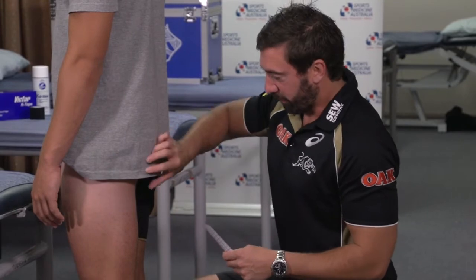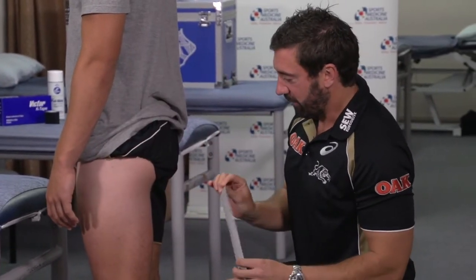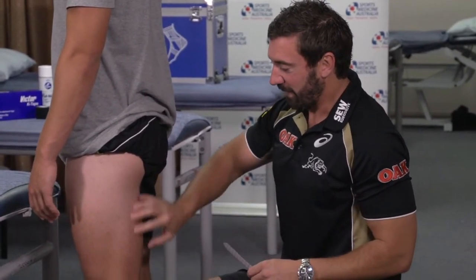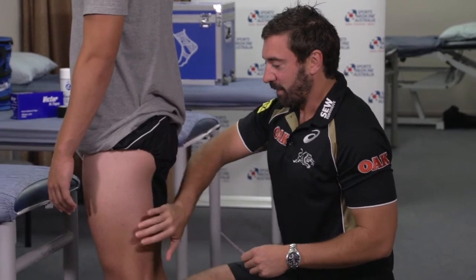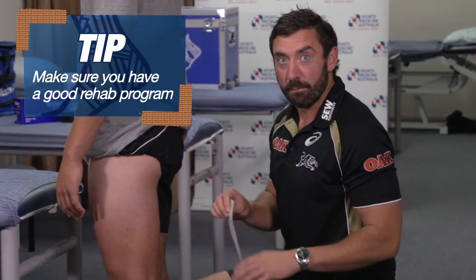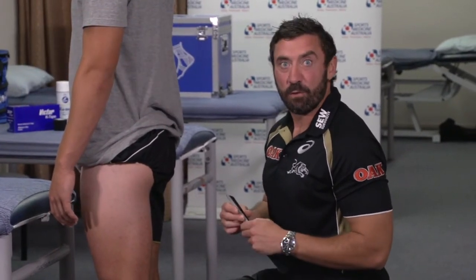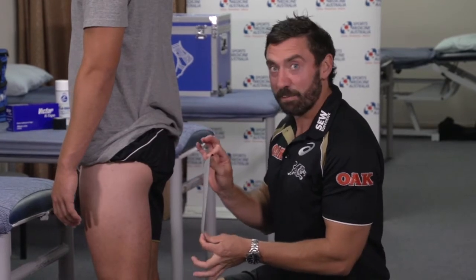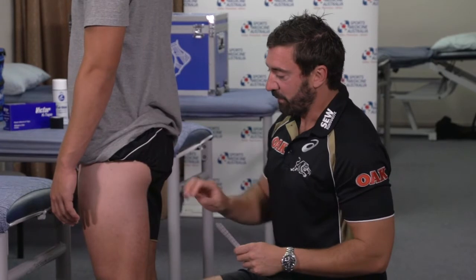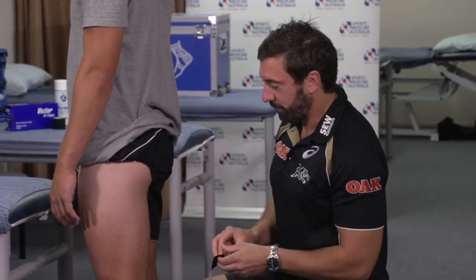This application is on a shortened hamstring. So again, we get left hamstring exposed. Again, I'll reiterate, you must make sure your diagnosis is correct. If there's weakness in the hamstring, despite the tape that we're putting on today, it doesn't make up for a good rehab program, which will be given to you by a physiotherapist. Strength is strength, and you need to get it through rehab. This is just to assist in the process. Say you're getting to start running, or he's having a little trouble with some of his hamstring exercises, we might use this tape just to give him a little kickstart along.